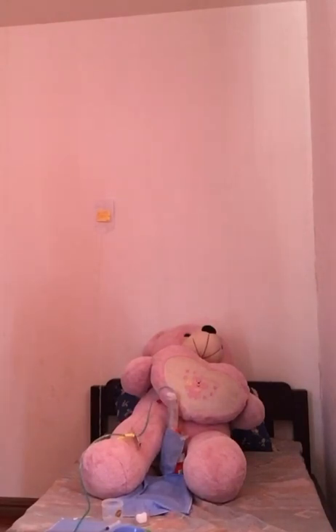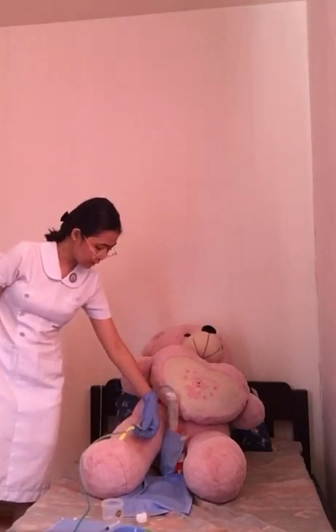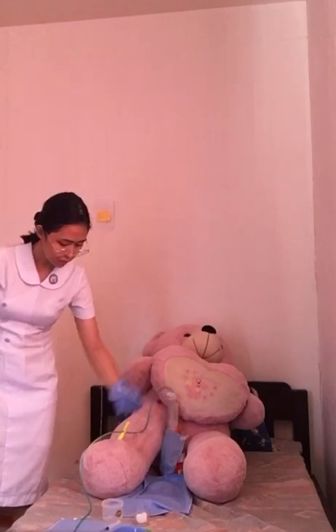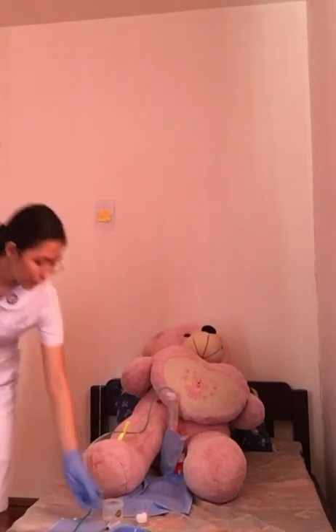Next, we will repeat the procedure as prescribed, and we will now be removing the clamp on the catheter. We will clamp this one.